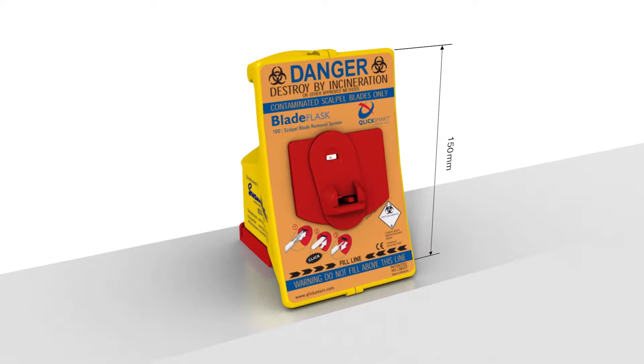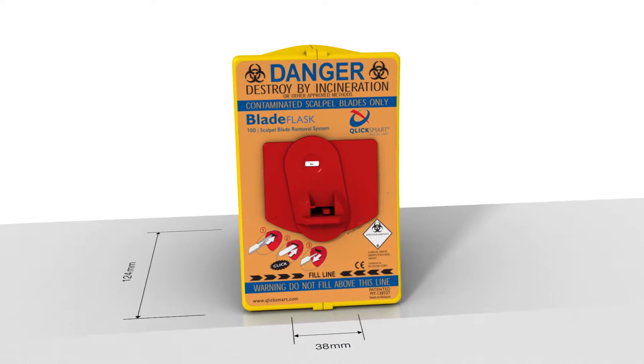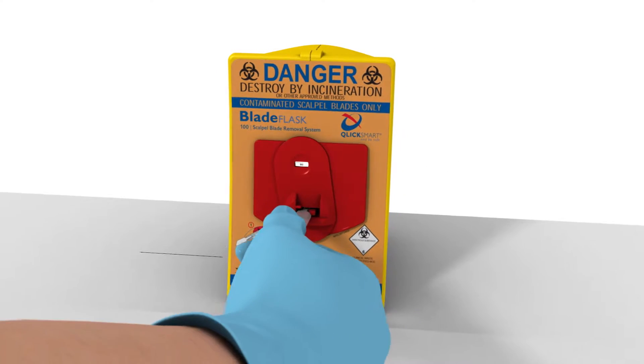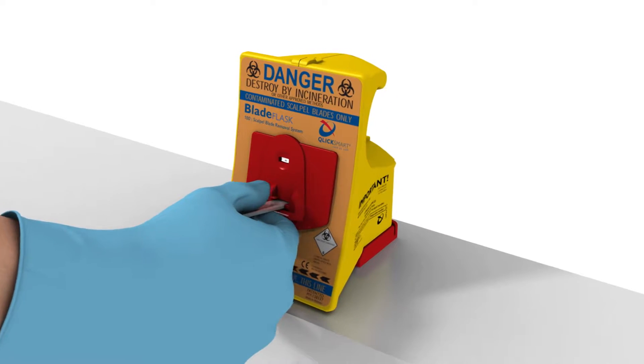This is the ClickSmart Blade Flask. It's the world's first single-handed scalpel blade remover. Blade Flask is quick and easy to use, enabling the single-handed safe removal of blades.